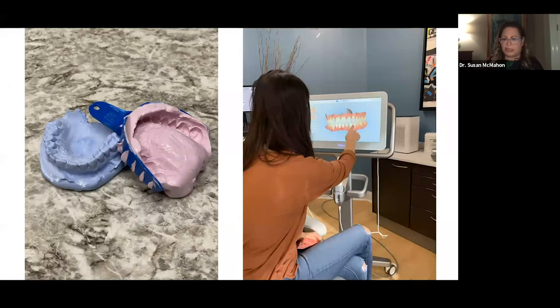So the other option is to scan it. And here you see a patient right after her scan, right up touching the iTero. They wanna sit up, they wanna touch it, they wanna see what it is. It's very easy to show them a reason why they might need an occlusal guard or something else.